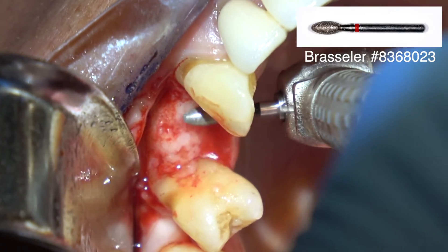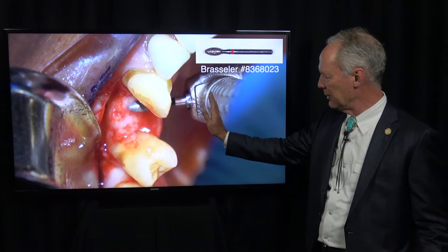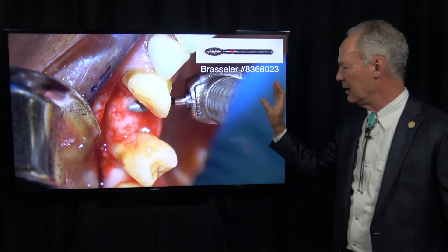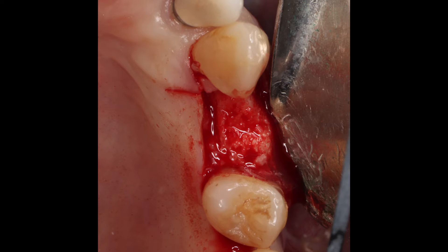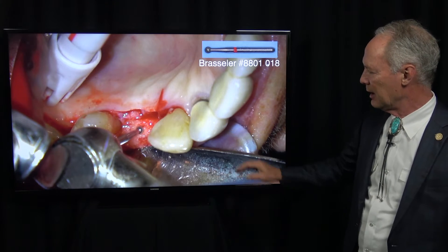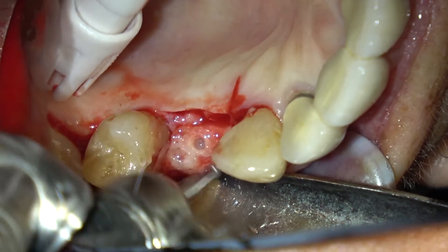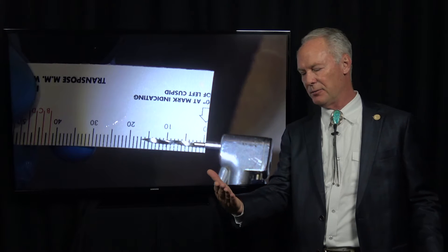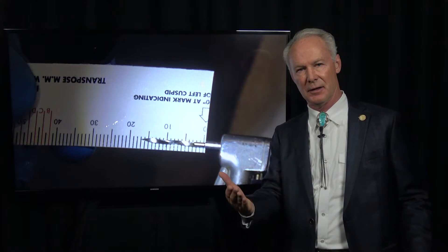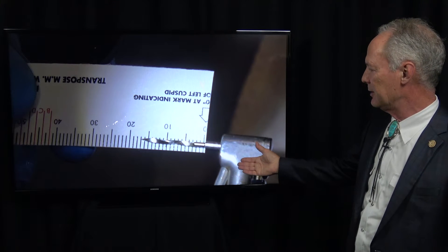I'm flattening the surface just a little bit so it's nice and flat and receives the implant better. This is a long shank number four carbide burr, and I'm making just a tiny divot at the spot where I want to place the implant. Then I'll look at it with my occlusal mirror and be sure that's the right site. You can also use a surgical guide — we've got implant videos on how to make a very simple surgical guide so you don't have to guess.